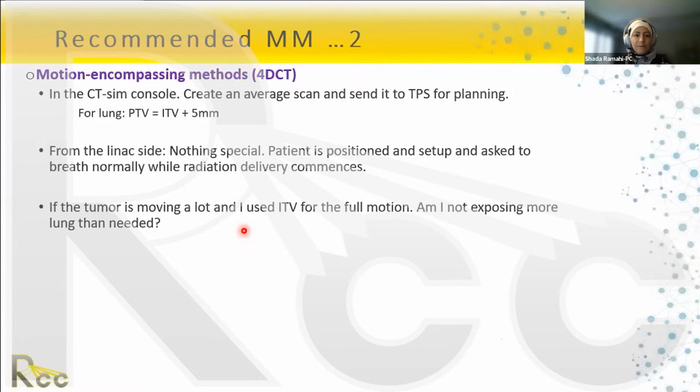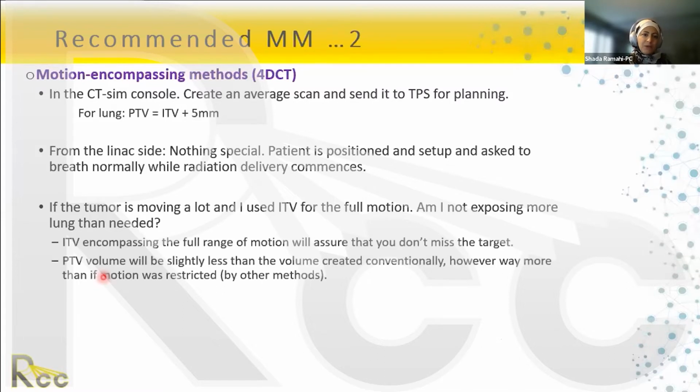Now, the example I showed you was really extreme, where you have a 4 cm motion of tumor. I've probably only seen that once, in this patient only. So clearly 4 cm is way too much of a range of motion. And what we want to do is make it smaller, right?